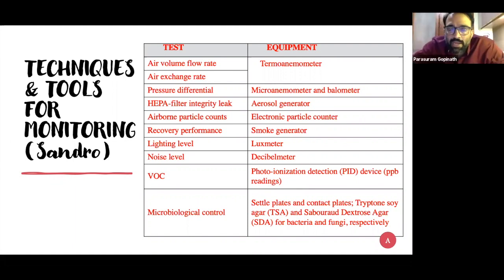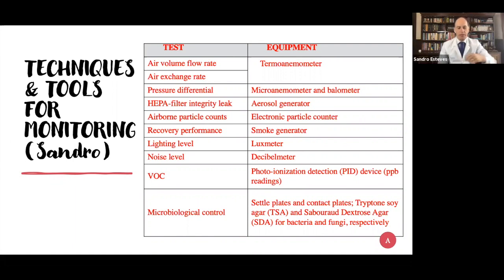One thing I would like to add is that I think a lot of people don't talk about the cryo room and the use of oxygen sensors, because maybe Sandro can comment on that. Yeah, absolutely, this is a must. We need to have an oxygen monitor inside the cryo room. And over here, it's also mandatory that we have negative pressure.